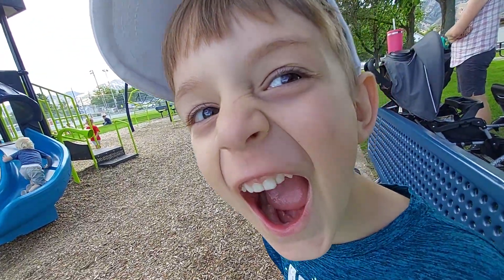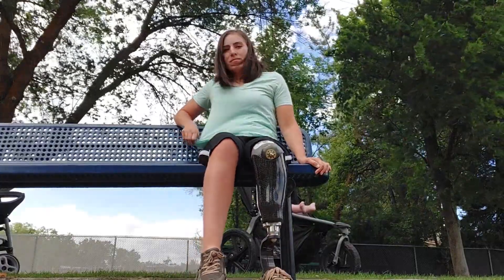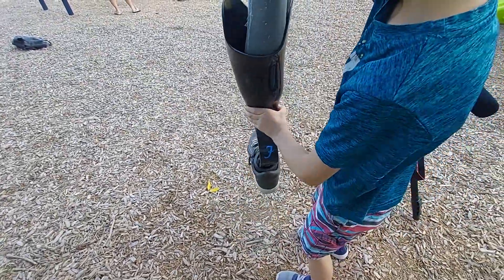I'm happy with my current pinlock system, though in addition to keeping my leg on, it occasionally provides much needed entertainment when horrified onlookers think I have a mega screw stuck in my leg. And if you want to know why I'm sitting there with my leg off in the first place, check out this weirdly entertaining video. Maybe I just ran out of duct tape. I'm Stefanina and thank you for joining me on my amputee adventures.